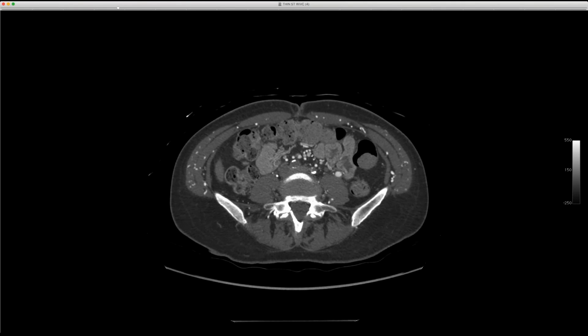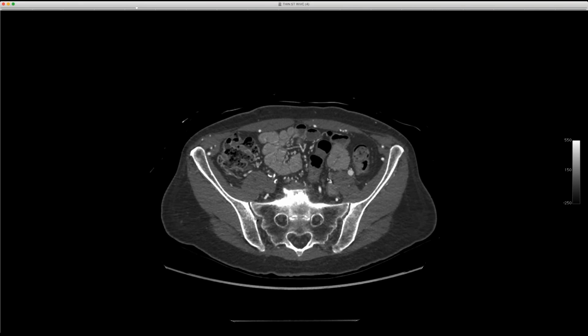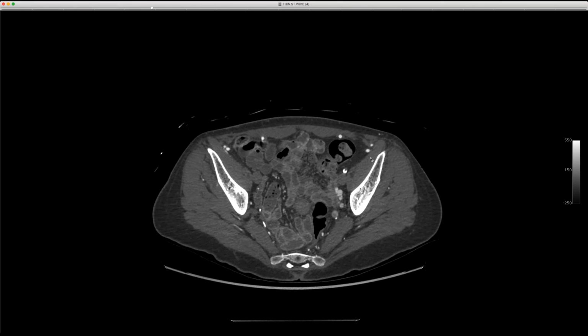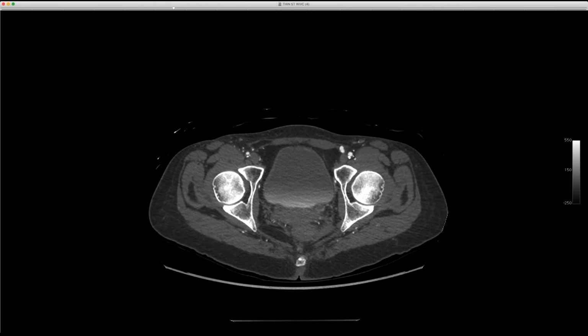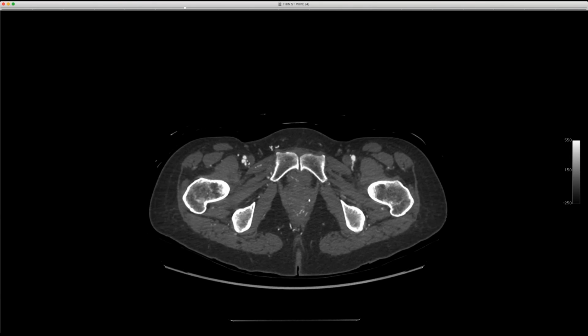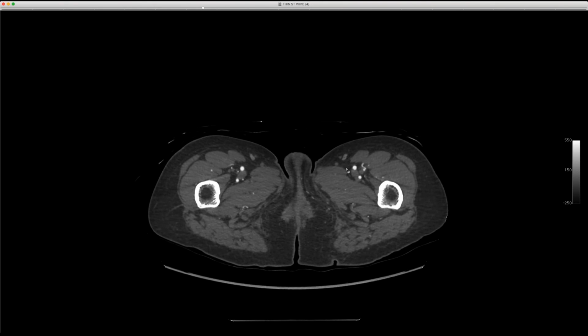Really pretty, and you'll see that the pelvic arteries will reconstitute distally. She actually had great 3-vessel runoff, but we got all these pelvic collaterals. So this is a Leriche syndrome, an aortoiliac occlusion. You see the left external iliacs reconstituted. Now you got both the common femorals and the superficial and deep femorals are widely patent there.